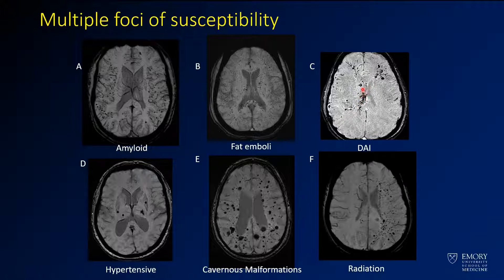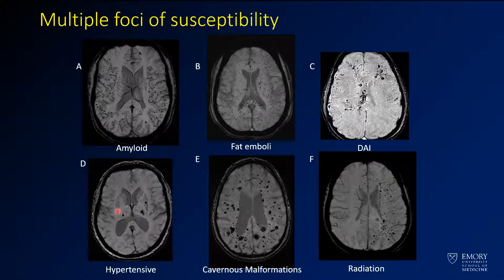For diffuse axonal injury, you see some involvement along the body of the corpus callosum, with a frontal and subcortical distribution. This next example shows the classic distribution of hypertensive hemorrhages: involvement of the caudate/putamen, the basal ganglia, and bilateral thalami — very classic for hypertensive hemorrhage.